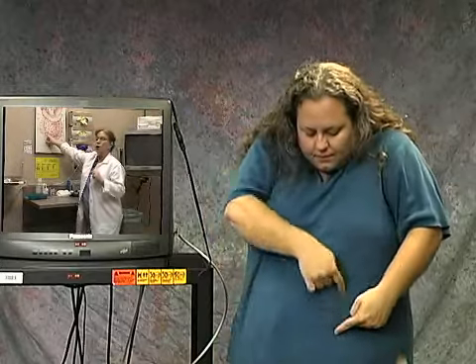You'll have a nurse on one side of the bed also, physician on the other side. The nurse will be giving the conscious sedation, which is similar to what is used in the other exam. During this test, most people experience the feeling of fullness as if they're going to have a bowel movement. This is from the air that the doctor is putting in. He needs air to expand the colon. He'll enter through the rectum, and as he's going through the colon, he's making his way all the way to the end of the large intestine where it joins the small intestine.